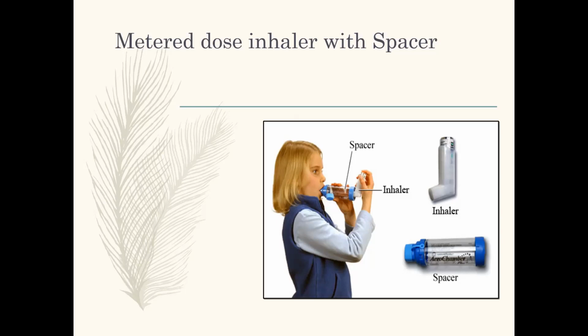They're going to depress the canister on the inhaler one time. They're going to inhale slowly through their mouth because they're breathing in through that mouthpiece, right? Inhale slowly through the mouth, hold their breath for 5 to 10 seconds, and then exhale through pursed lips. They're going to need to take the spacer out of their mouth to exhale. They can wait 1 minute and repeat if it's prescribed to do more than one puff.